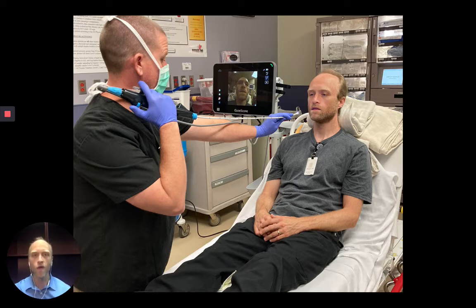The advantage of the oral route is that you can place a larger standard endotracheal tube. The nasal passage will accept generally only a 6.0 to maybe a 6.5 tube. The advantage of the nasal route is that it is technically easier to maneuver the scope through the cords, as the nasopharynx leads directly to the larynx. When going through the mouth, the turn is much sharper, making it more challenging.